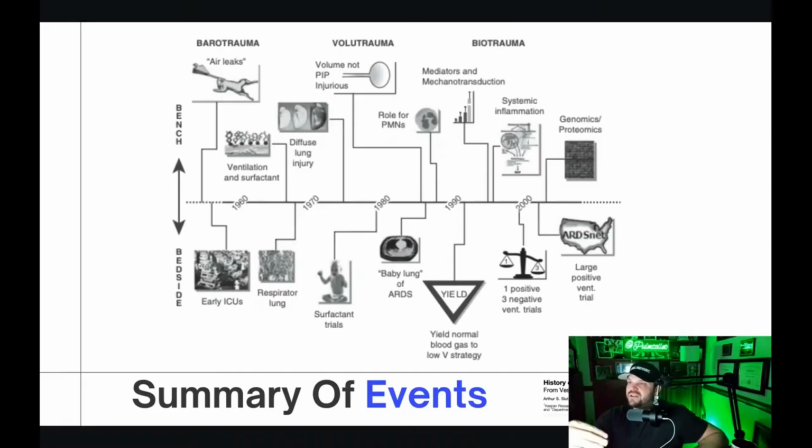And we should aim to ventilate those with smaller volumes. Because if we ventilate them with larger volumes, or the same amount of volume as a normal lung, we're going to injure it. The next frontier is certainly things like driving pressures, things like mechanical power. It's really figuring out how we can set PEEP with intention and not just guess. So that's later down the line.